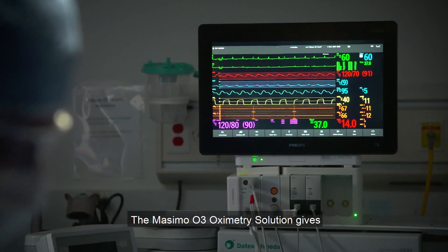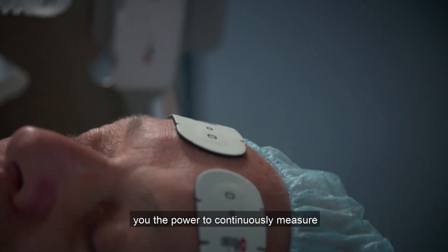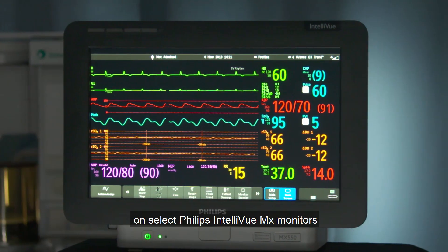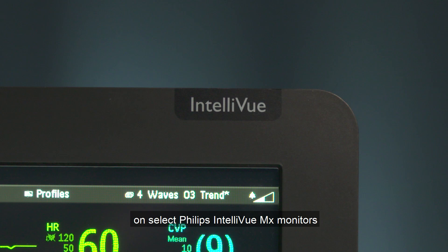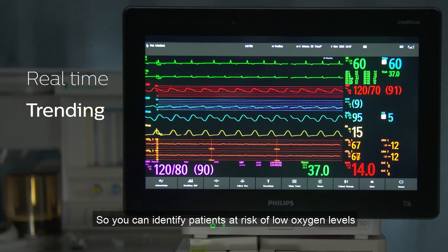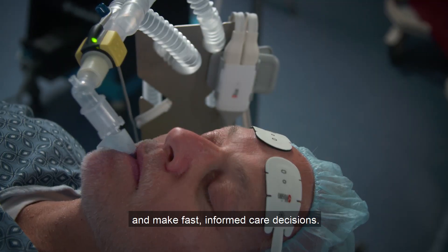The Massimo O3 Oximetry Solution gives you the power to continuously measure and view cerebral oxygen saturation directly on select Philips Intelliview MX monitors in real time and trending, so you can identify patients at risk of low oxygen levels and make fast, informed care decisions.